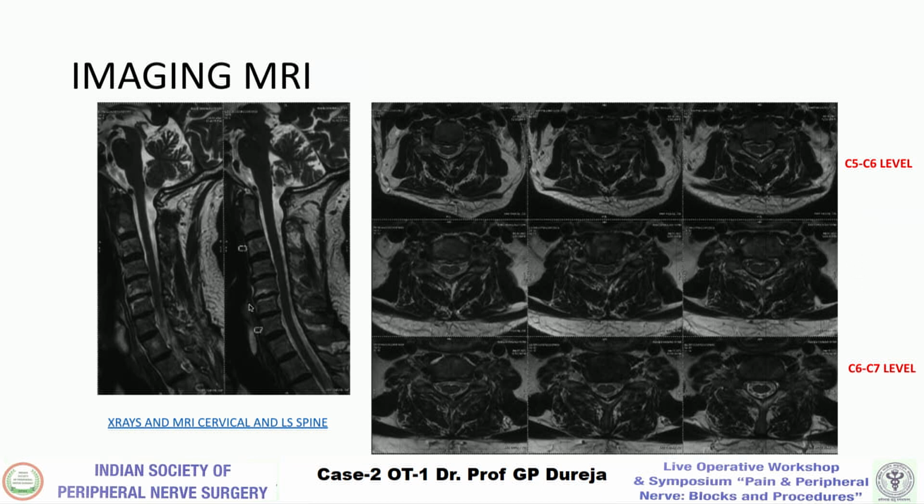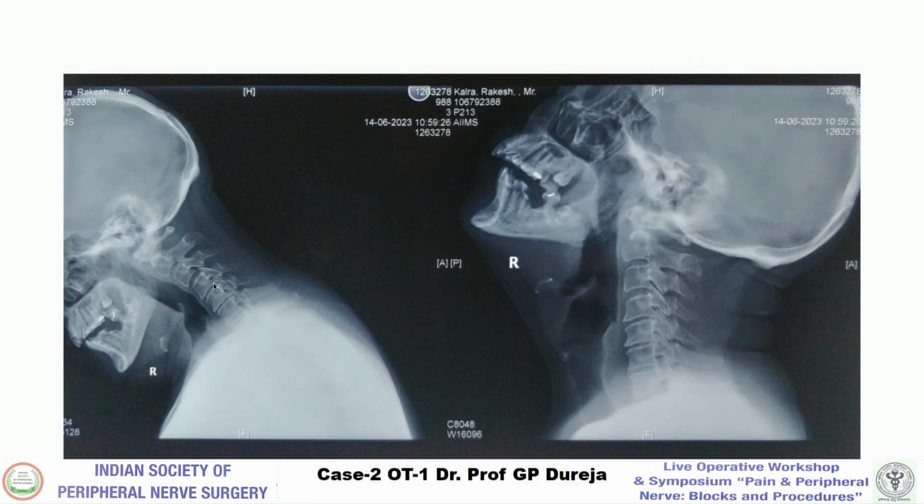First, show the X-rays. There is cervical spine straightening on the lateral X-ray. Sir, we can also note reduction in height at the C2, 3, 4, 5 and 5, 6 levels, on the lower cervical discs.